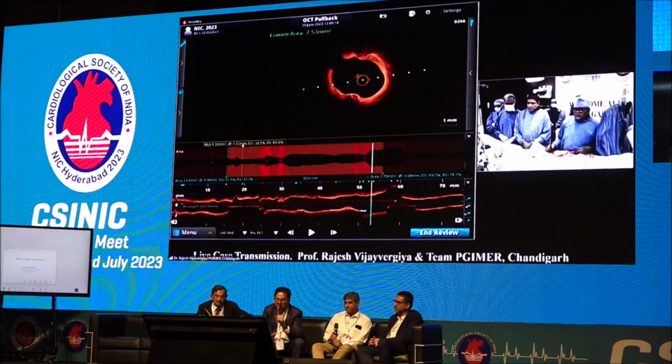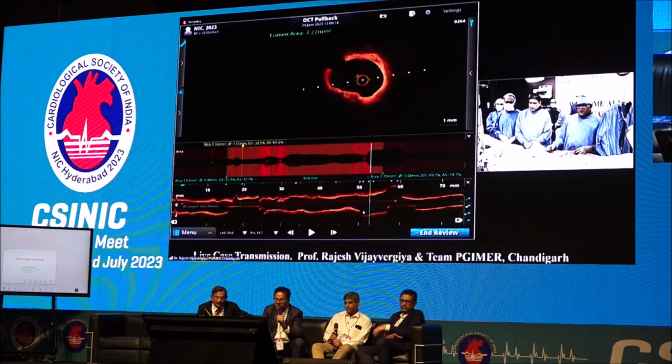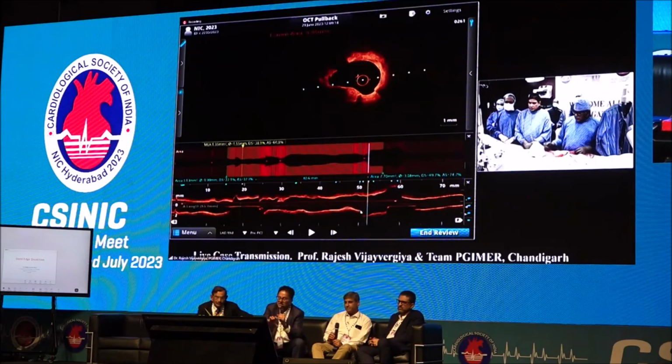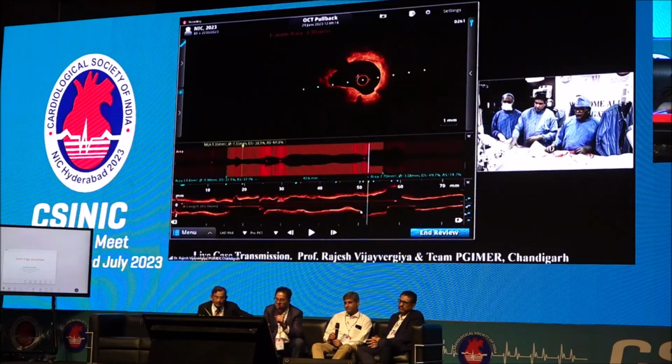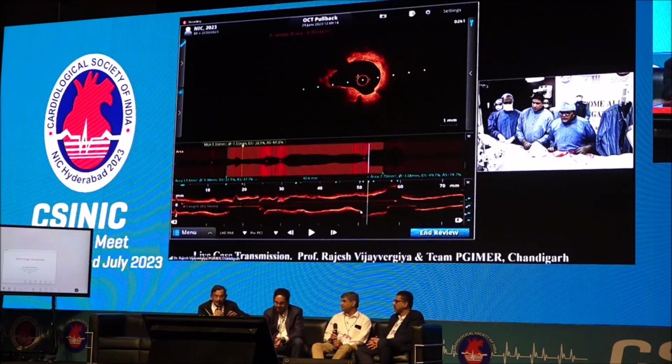But Rajesh, your strategy though is a provisional single stent strategy right now. Absolutely right. And you may change, but right now, having a plan obviously is very important. So you'll first double wire, you'll balloon the circumflex, then you'll stent the LAD, and then provisionally deal with the circumflex again. Is that true? Absolutely right. So you can proceed to another case, and meanwhile I do some work over here, and then you can revert back to me. Is it okay?